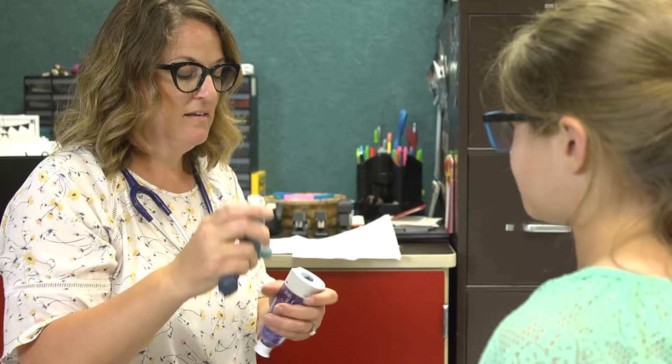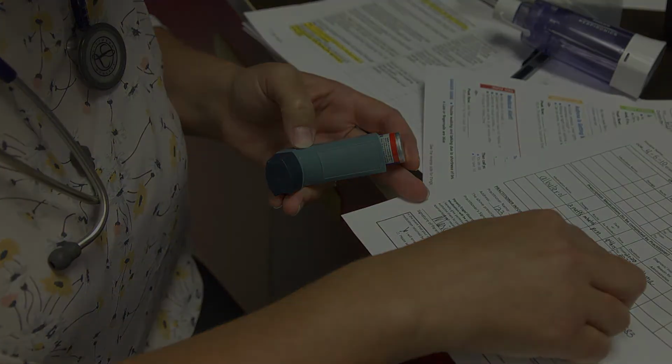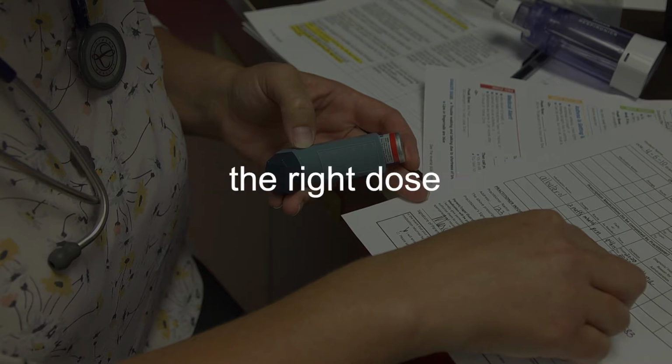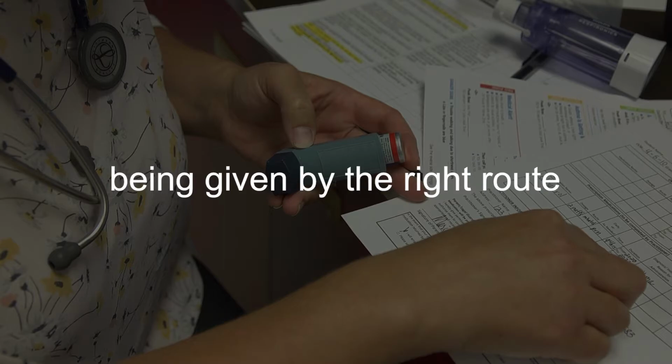medication. Quickly review the 5 rights once again while checking the albuterol to be sure it is for the right child, the right medication, the right dose, being given at the right time, being given by the right route.